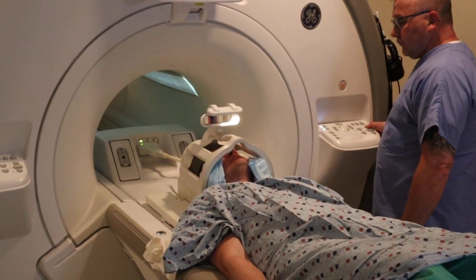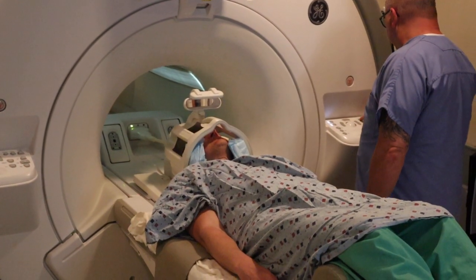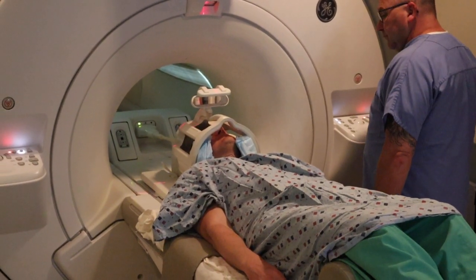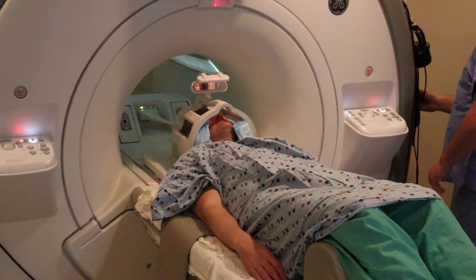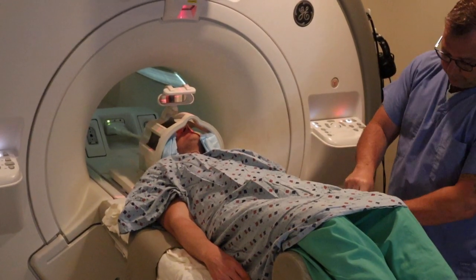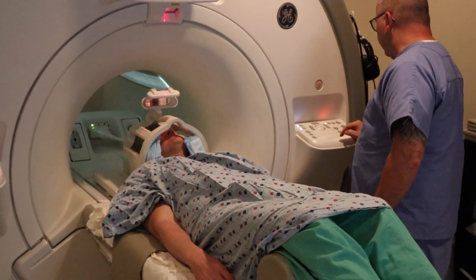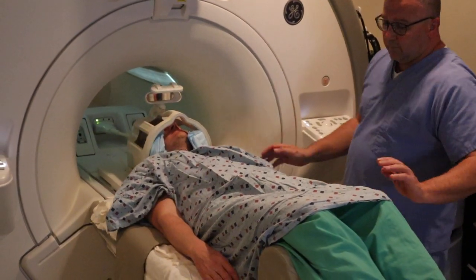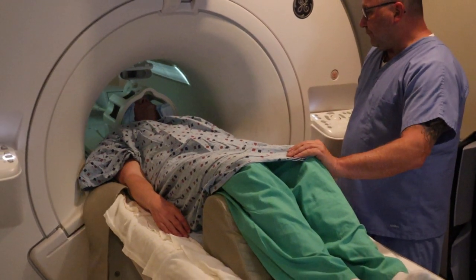At this point the technologist is going to enter the patient into the bore, turn the alignment light on, and that alignment light is going to be right on the nasion — the landmark for the brain study. He's going to give them the panic ball in case they need communication with the technologist, then landmark and advance the scan. This is how you position for an MRI brain study.